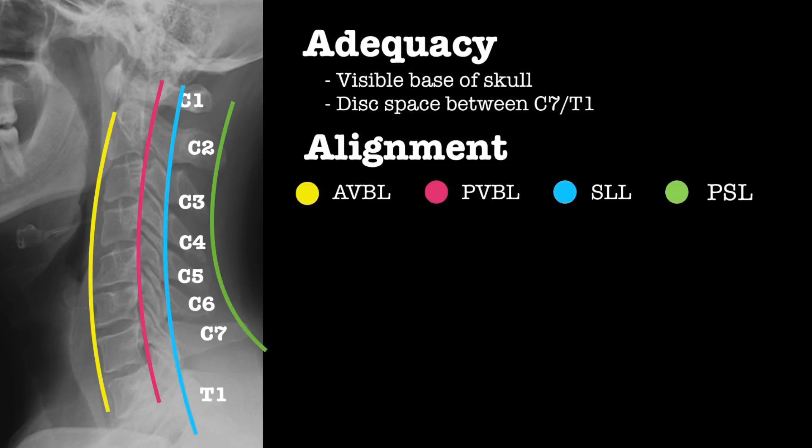For alignment, look at the anterior vertebral line (in yellow), the posterior vertebral line (in pink), the spinal laminar line (in blue), and the posterior spinous line (in green).